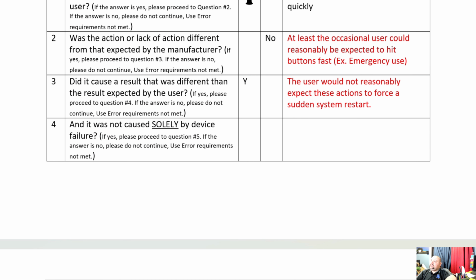So, is it only caused by device failure? Because part of this requires rapid user inputs. This doesn't happen unless it's in relation to how quickly the user is hitting the on-screen command buttons. So is it solely, is it 99.9% device failure and 0.1% user interactions?